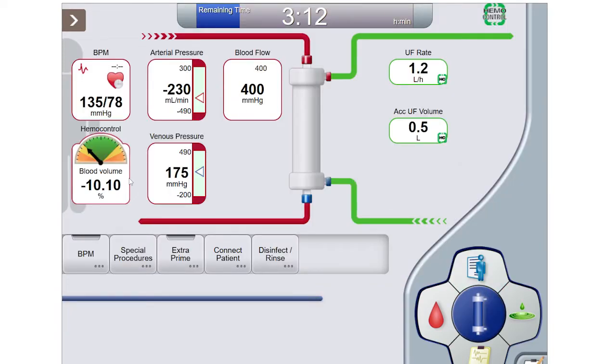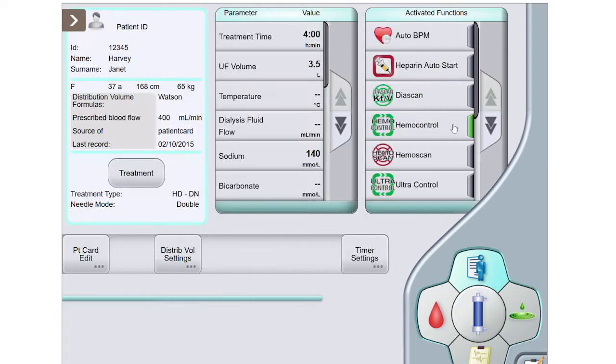Okay, so we're going to carefully consider our patient's condition. We've checked in with the patient. We're not seeing any hypotension. This is a recent blood pressure and we're still looking good. Not a significant discrepancy from their previous reading. They're not having any cramping, no dizziness, no complaints. Their blood volume has dropped significantly, but I would check to see if this was unusual for the patient. If we're seeing this combined with an elevated pulse, that would be concerning, so that would be something that we would note. But presently, we're not seeing anything of concern.